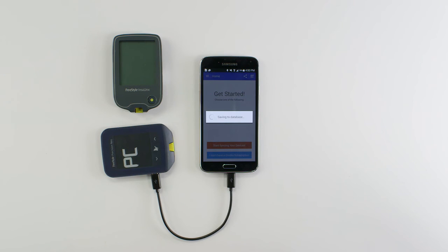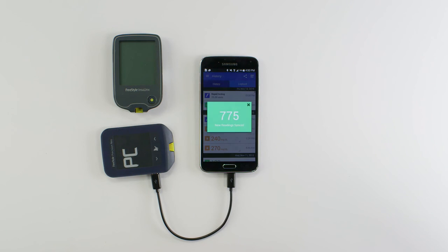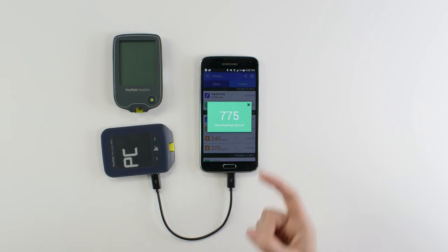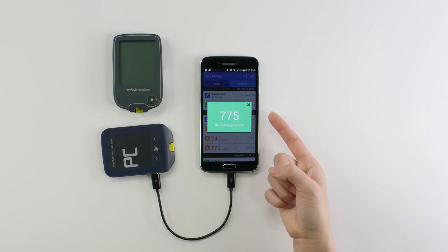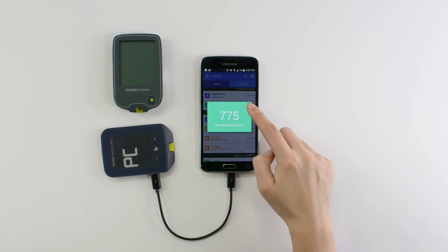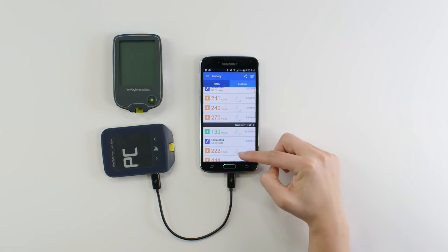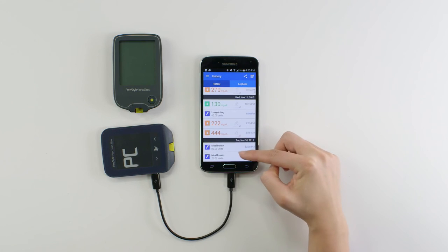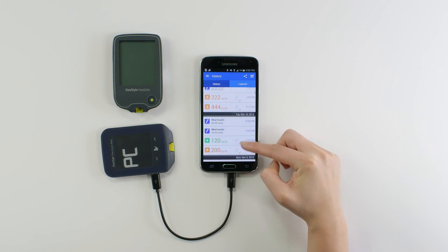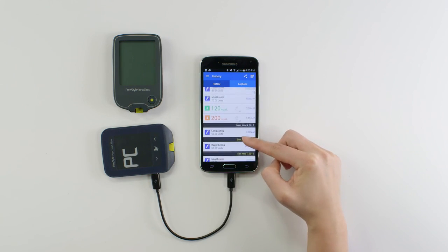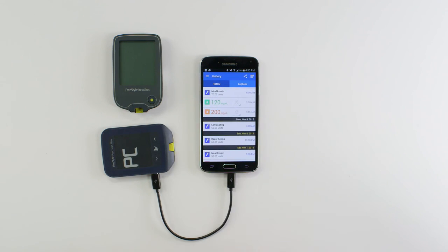Once data is saved to the database, you'll see a window that provides the total count of data synced. You've learned how to sync a freestyle USB blood glucose meter like the Precision Neo or the Insulinks with the Gluco app for Android. Happy syncing!